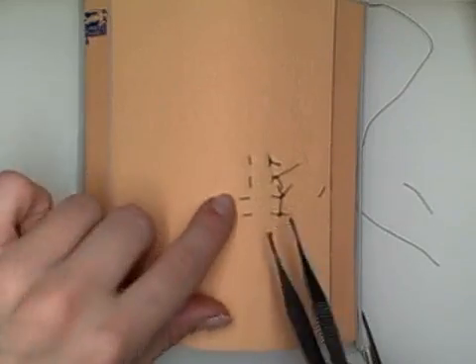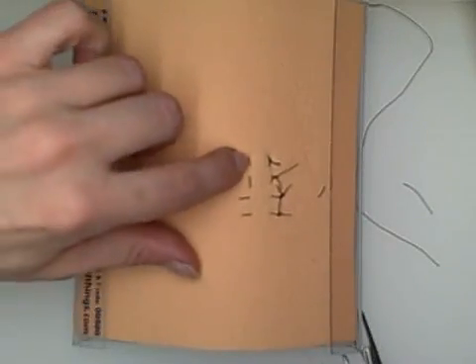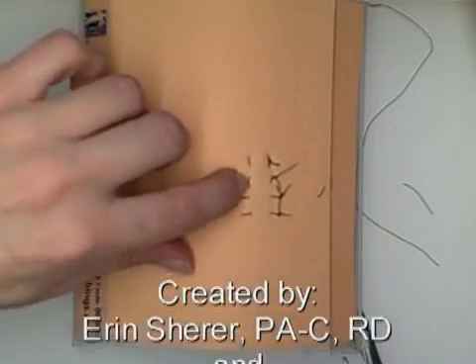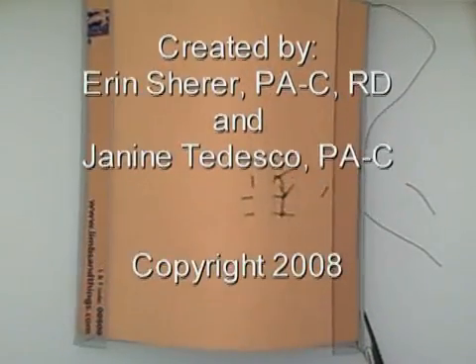So can you see the differences? This is the vertical mattress and this is the horizontal mattress. Okay, so let's take a look.